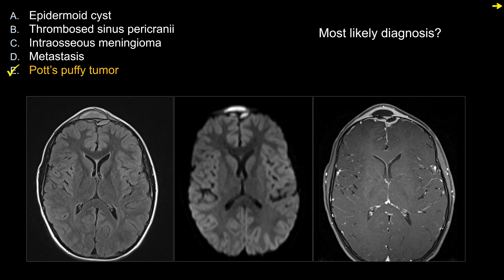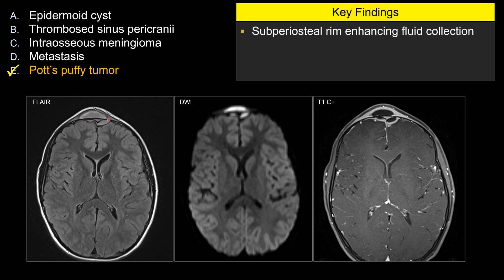The best choice in this case is choice E, Pott's puffy tumor. Let's look at some of the key features that made choice E the best answer here. A fluid collection overlies the frontal calvarium and is bright on FLAIR, so there is not complete suppression like you see with CSF or pure fluid.